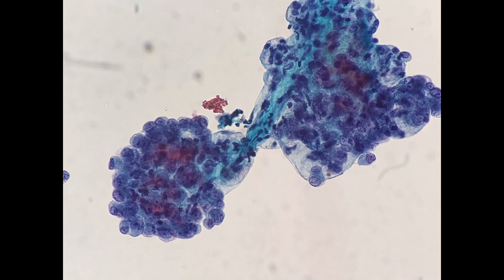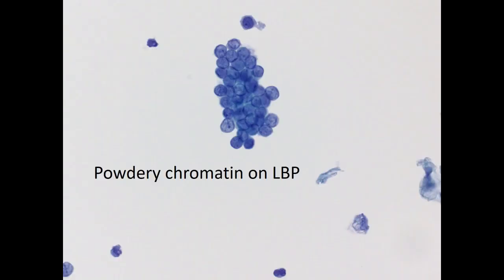On liquid-based preparations, you may also see a papillary arrangement with fibrovascular cores, and the nuclear features may be a little more difficult to appreciate, with a vague convolution of the nuclei. Usually the powdery chromatin of PTC is what catches my eye on a liquid-based preparation — the cells are powdery and the nuclear contours, while still evident such as these little grooves, are much more subtle on these LBPs.